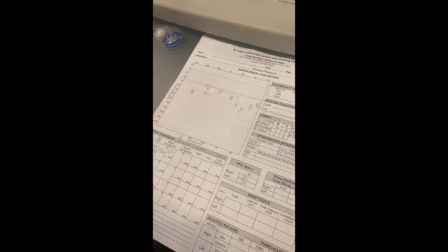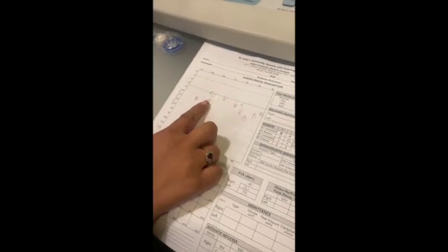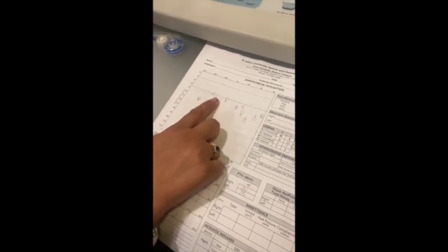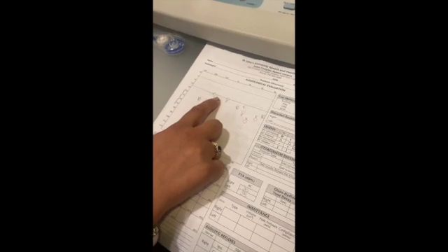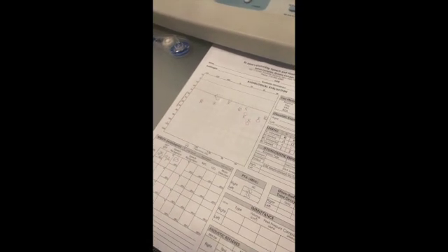So the test ear in this example is your left ear, and the non-test ear is your right ear. So this means that your oscillator should be on the left side because you will be presenting tones on your left side. And your non-test ear is your right ear, which means narrow band noise or masking noise is presented in this ear. So we want to distract the right ear so that it's not influencing the left ear in this case.